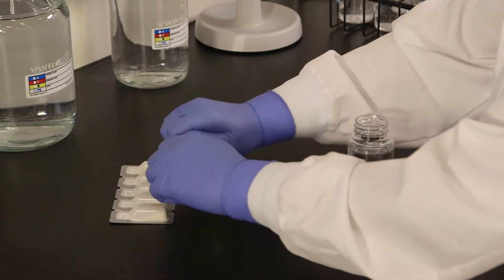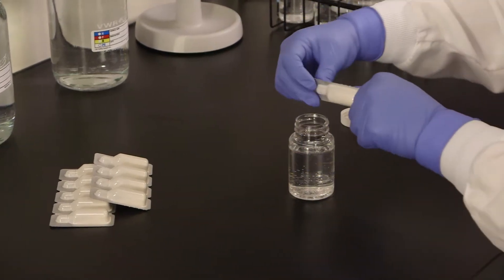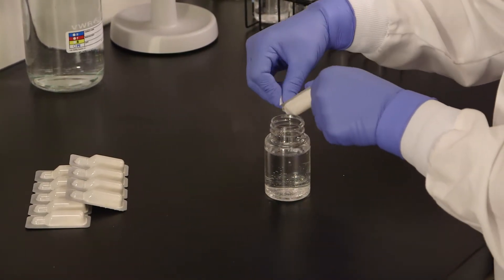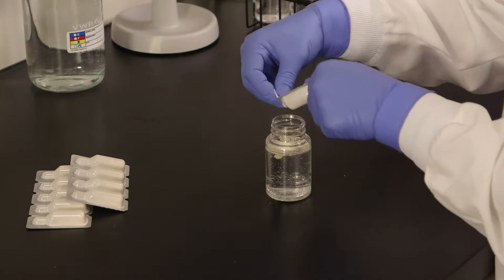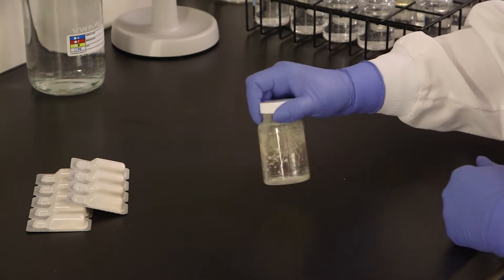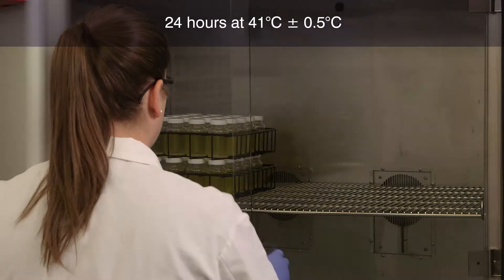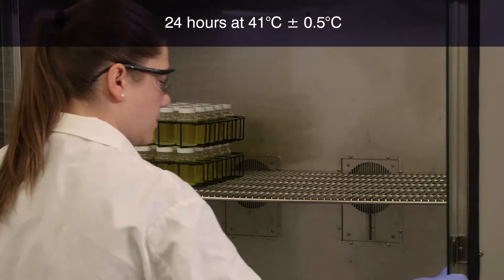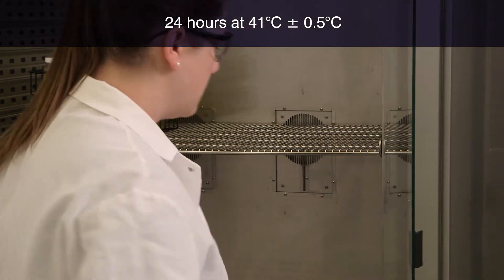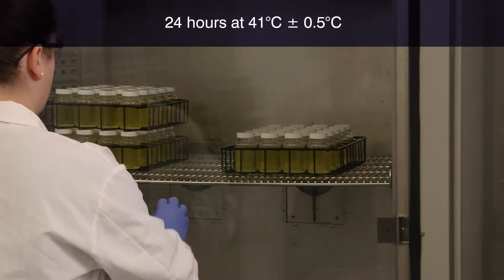Separate one reagent pack from its strip, taking care not to accidentally open the other packs. Snap open the reagent pack and pour the powder into a 100 ml water sample. Cap the vessel and shake to dissolve the Entralert powder. Some particles may remain undissolved. Incubate for 24 hours at 41 degrees centigrade, plus or minus 0.5 degrees centigrade, or according to your local regulations.